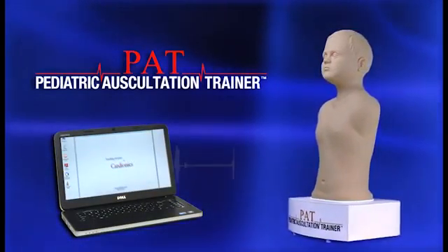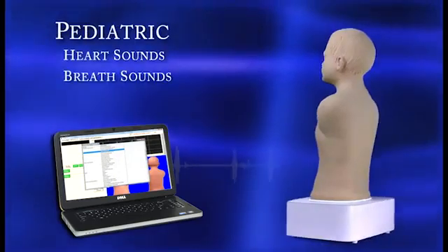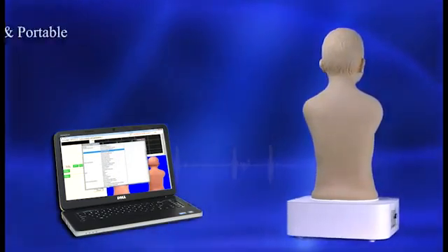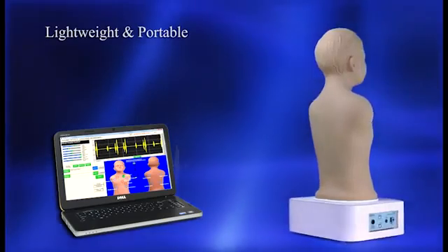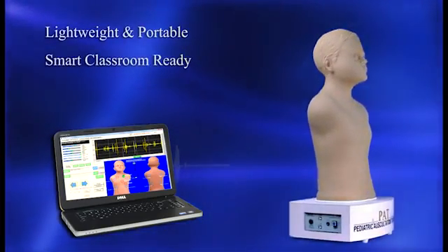PAT, the pediatric auscultation trainer from Cardionics, is the latest innovation in teaching and learning critical pediatric auscultation skills and concepts. Weighing less than 20 pounds, PAT is portable and easy to use. Its software interface can be integrated with any smart classroom system.